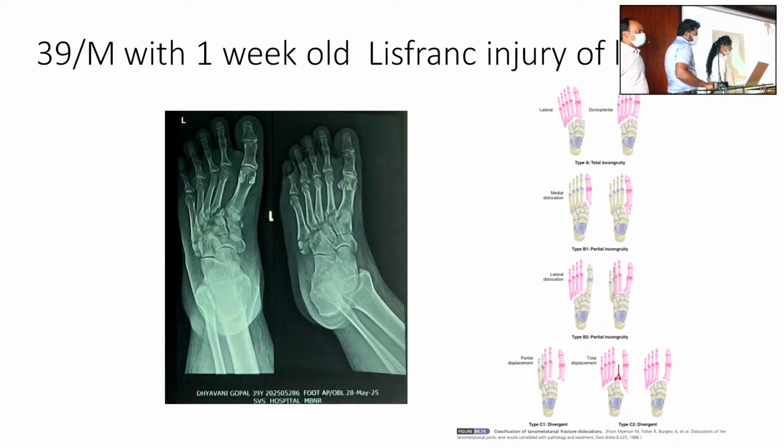Is this not a medial column? Medial column. The cuneiform is fractured. Yes, sir. And how did you say it is a B?